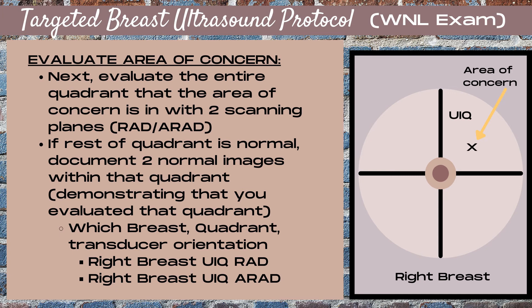Annotate these quadrant images with which breast you're in, the quadrant you're in, and the transducer orientation. For this example: right breast, upper inner quadrant, radial — and right breast, upper inner quadrant, antiradial.